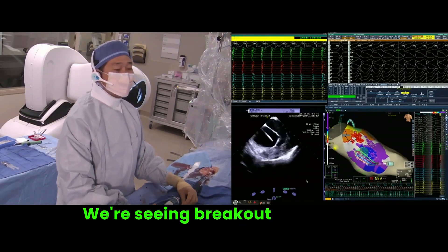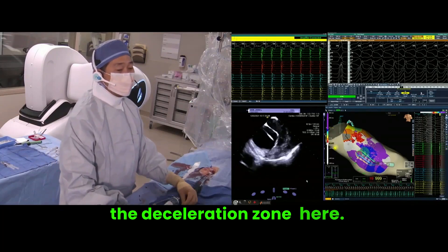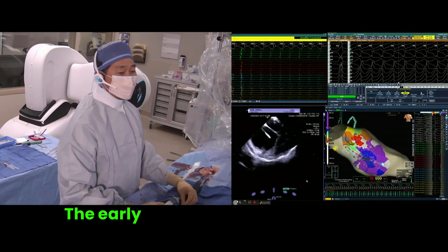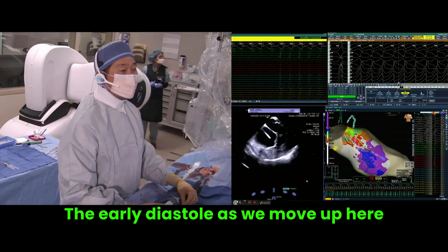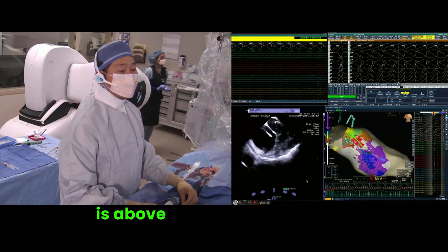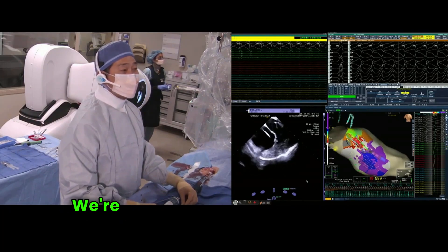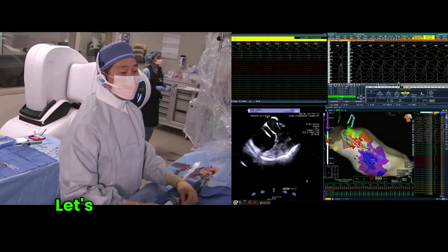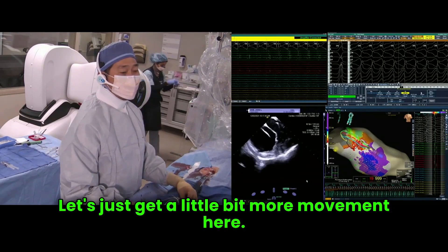We're seeing breakout away from the deceleration zone here, but where's diastole? The early diastole, as we move up here, is above this little line of block. We're coming underneath the aortic valve. Let's just get a little bit more movement here.